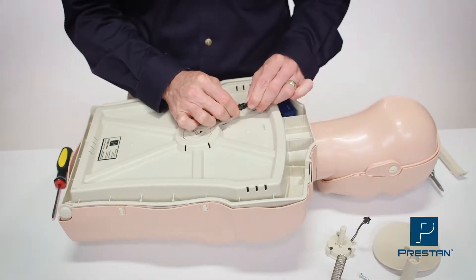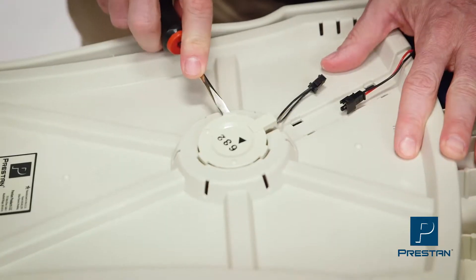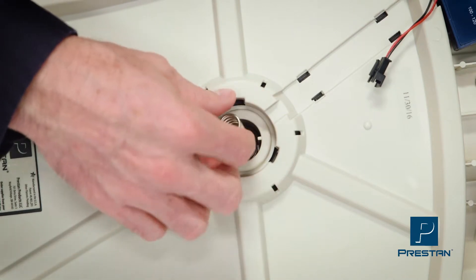If you're using a monitored mannequin, disconnect the clicker from the monitor. Pop out the clicker, then remove the small spring and piston sleeve.